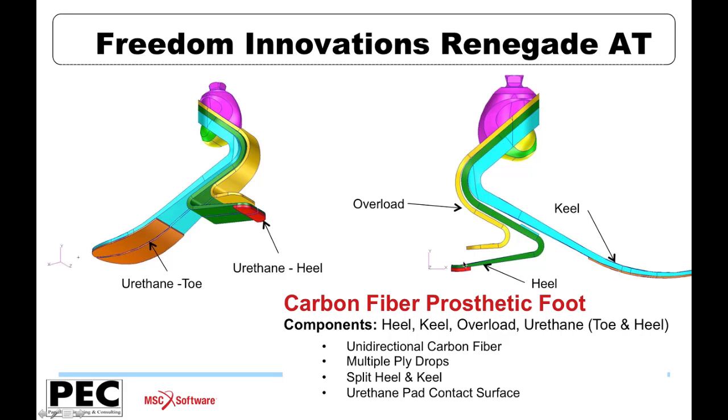Another aspect that we're going to be looking at here today as one of the important design parameters is what's shown in red here. It's just a urethane pad on the heel. There's another one on the toe, but we're going to be focusing on the heel component there in terms of thickness and length of that design component and how it affects. It's primarily there to prevent wear of the material from contact with ground or something.